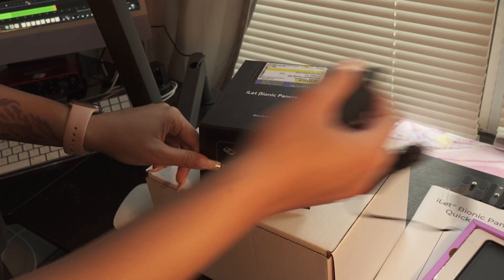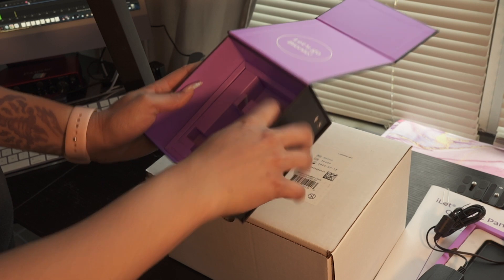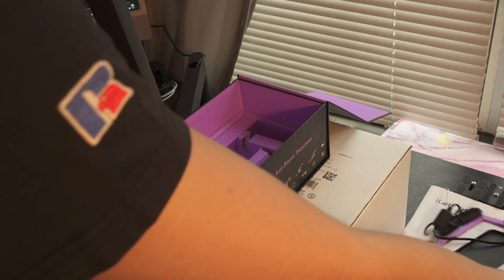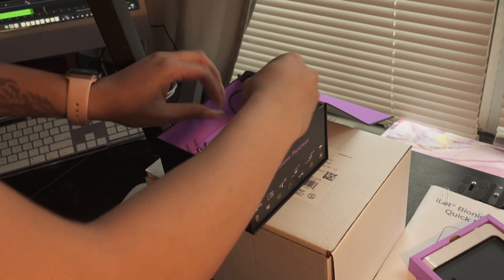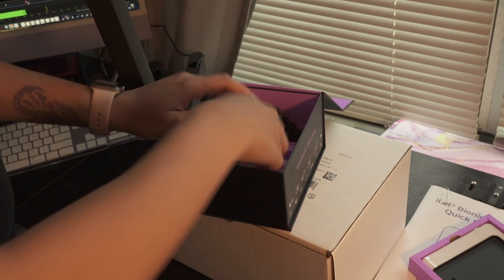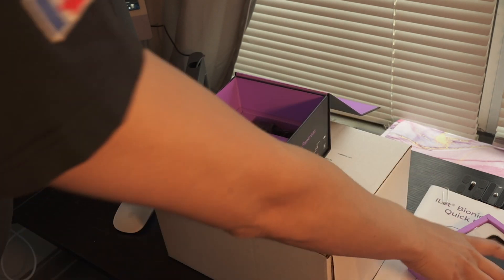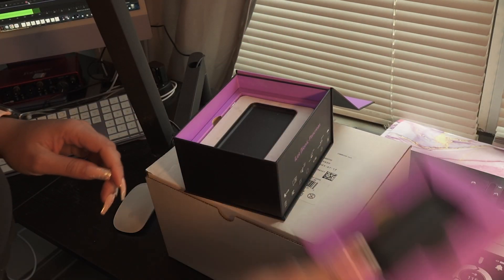I actually have to charge my iLet for my appointment, so I should probably put it back so I don't lose anything. I do like the packaging — it's really cute. I like how neat everything came, and it's all stackable. It comes in layers — I love that.